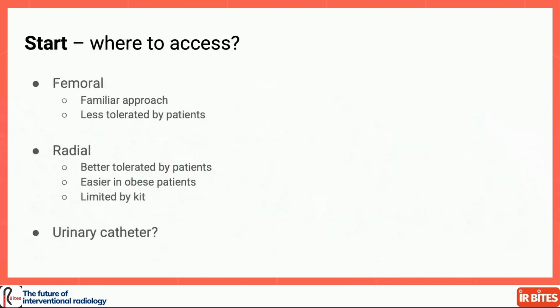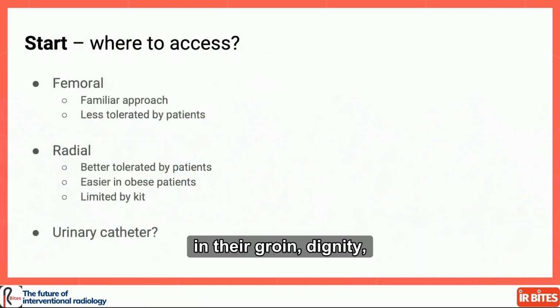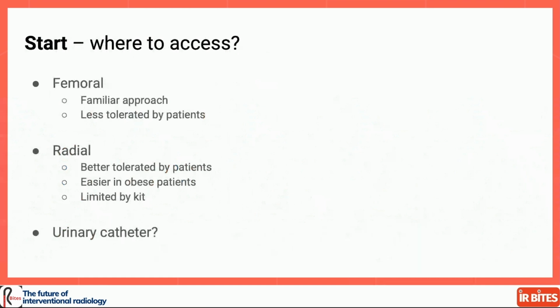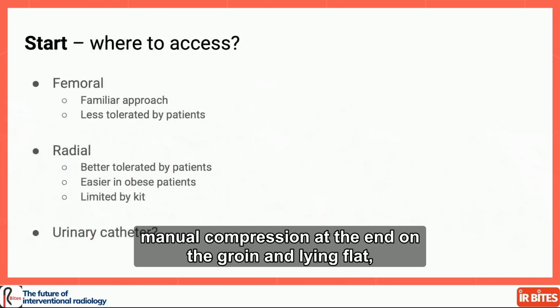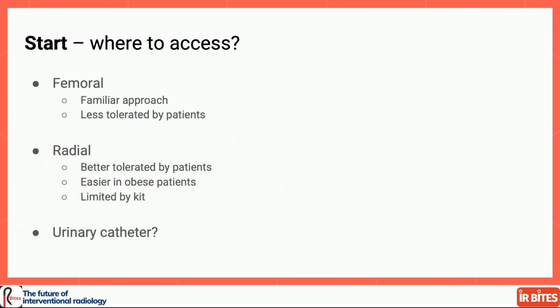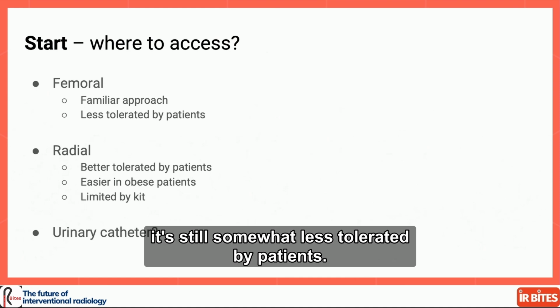Where to access? Femoral is a familiar approach, less tolerated by patients. You can imagine, they're having something in their groin, dignity, and also in terms of having manual compression at the end on the groin and lying flat. All those things put together, despite the advent of closure devices, it's still somewhat less tolerated by patients.